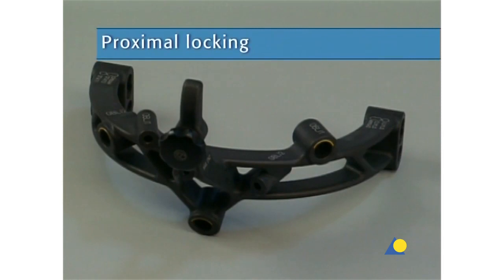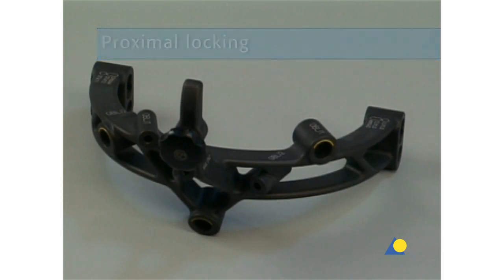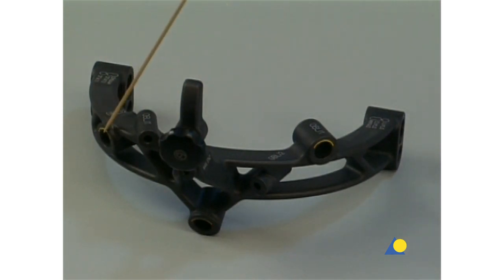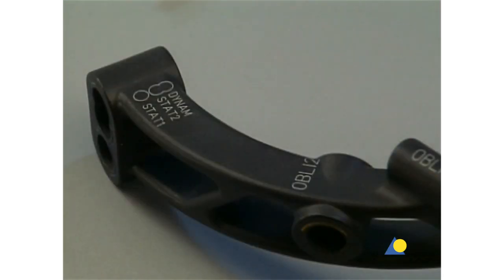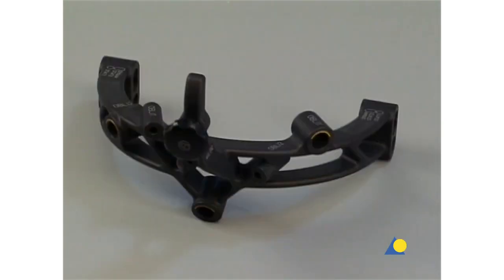The aiming arm can be used for different proximal locking options, which are color-coded on the aiming arm and the corresponding instruments. Three locking options, color-coded yellow, are combined with cancellous bone locking screws for ideal stabilization of the proximal fragment. Two medial lateral locking options, color-coded blue and green, enable primary compression, secondary controlled dynamization, or static medial lateral proximal locking. In this exercise, static medial lateral proximal locking is demonstrated. As alternatives, dynamic proximal locking and oblique proximal locking will also be introduced.